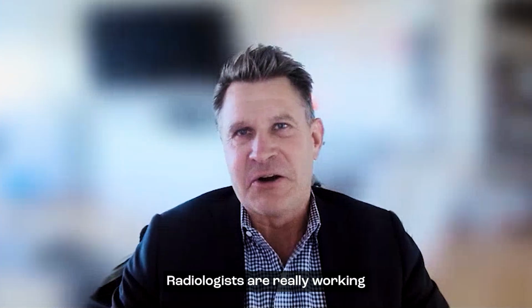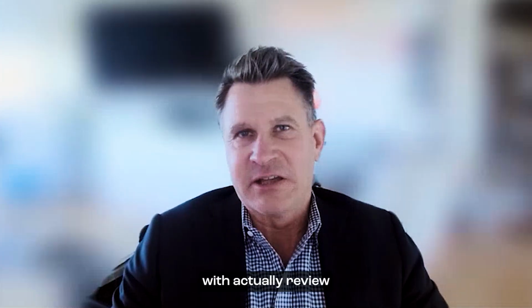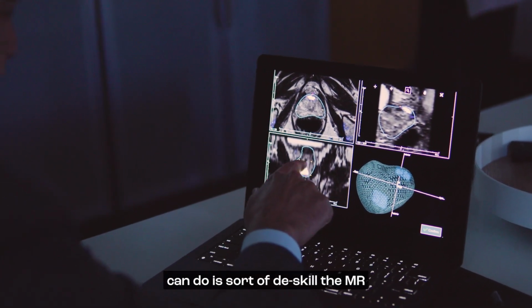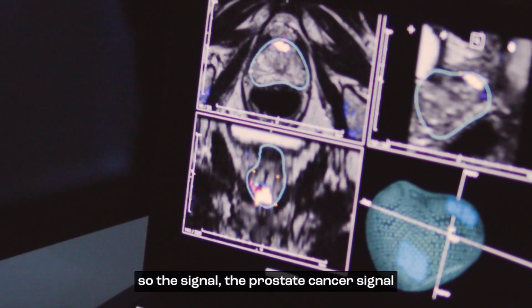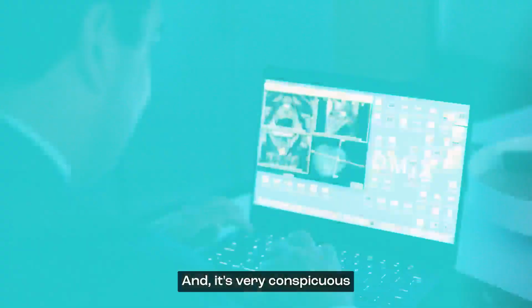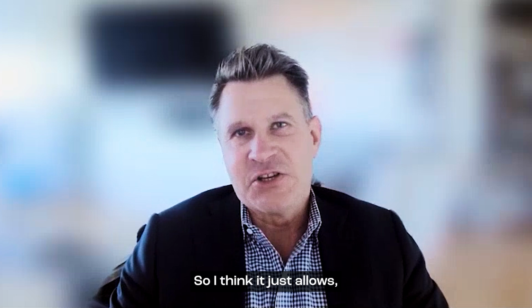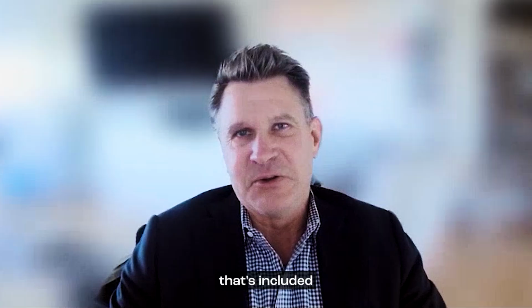Increasingly, radiologists are working hand in hand with our clinical partners. Many of the urologists that I practice with actually review the images themselves and with their patients. And so I think in a way, what RSI can do is sort of de-skill the MR. The RSI map is positive contrast, so the prostate cancer signal will really light up like a light bulb. It's very conspicuous and very easy to see, even for the inexperienced reader, urologist, or patient for that matter. So I think it allows for better conveyance of the findings to everyone included in the conversation.